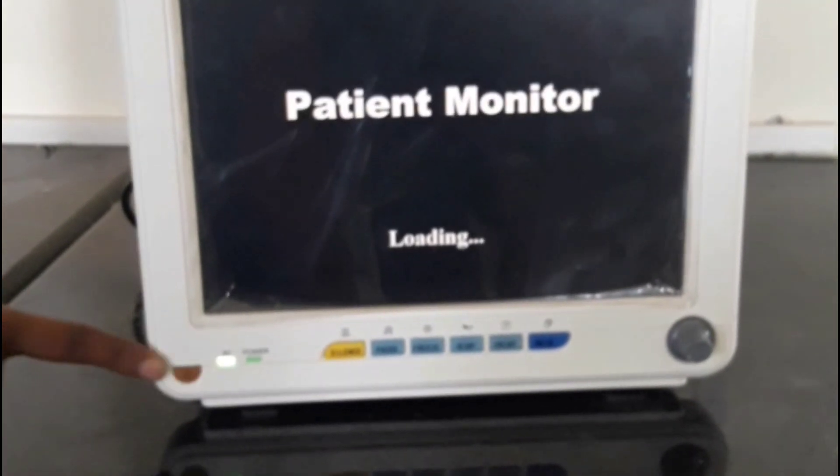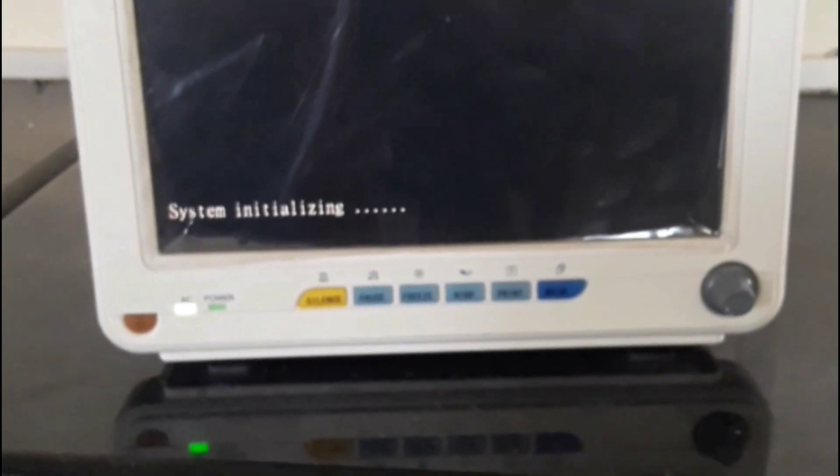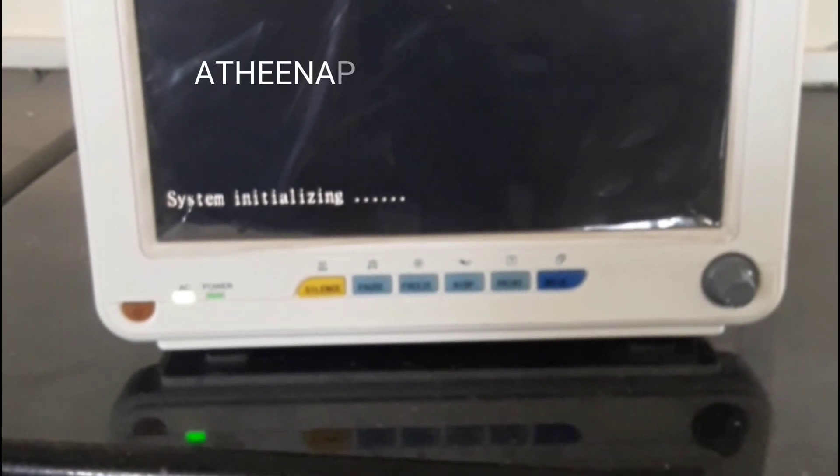This patient monitor is very portable and can be lifted anywhere. It weighs around 2.5 to 4 kg. To switch on the patient monitoring system, connect the 230-volt power supply and give a long press of the power button. The system will turn on within two to three seconds, and the display will be active within three to five seconds.